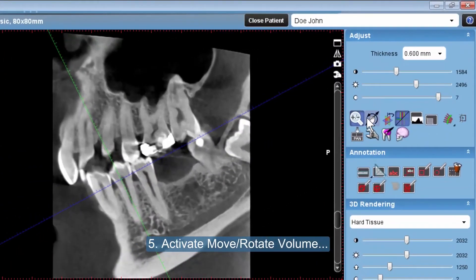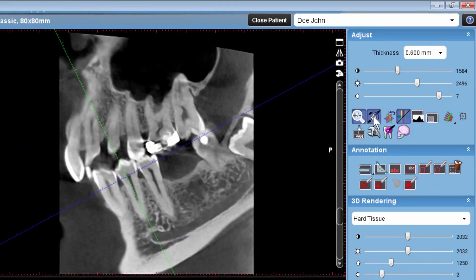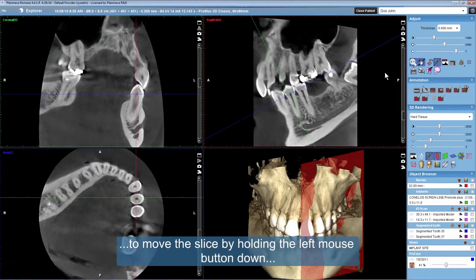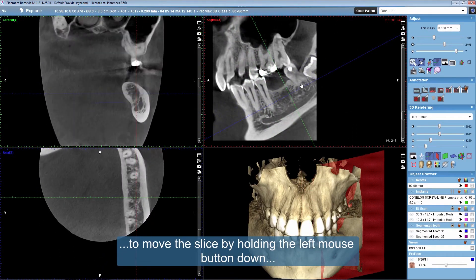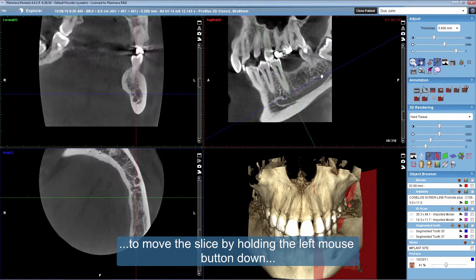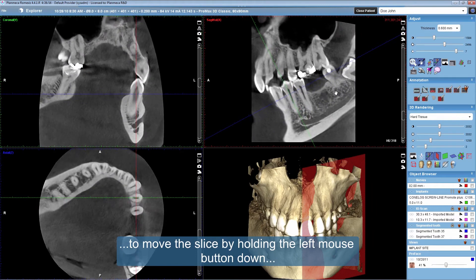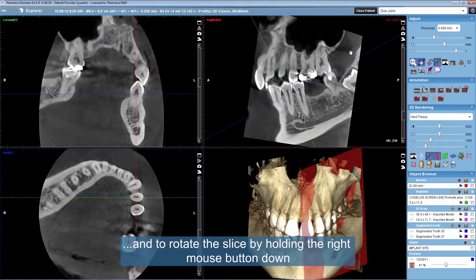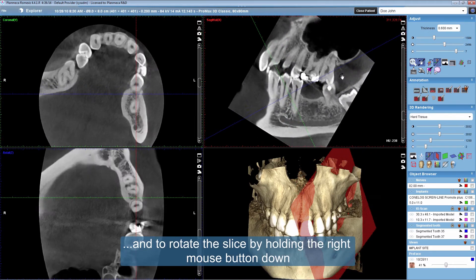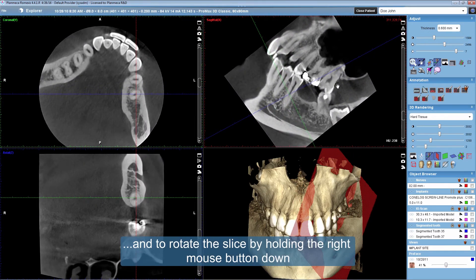Activate move or rotate volume to move the slice by holding the left mouse button down, and to rotate the slice by holding the right mouse button down.